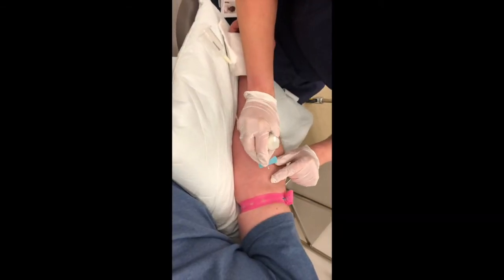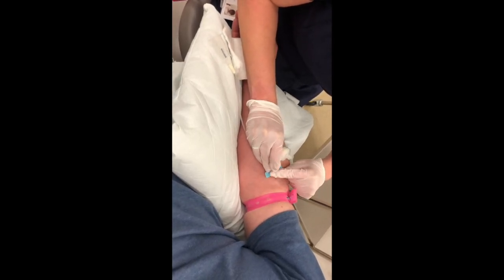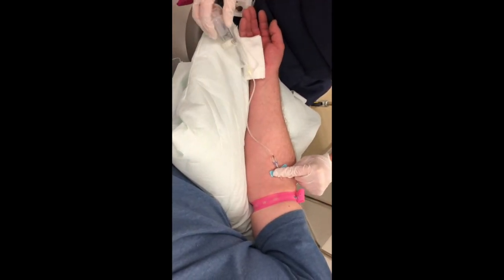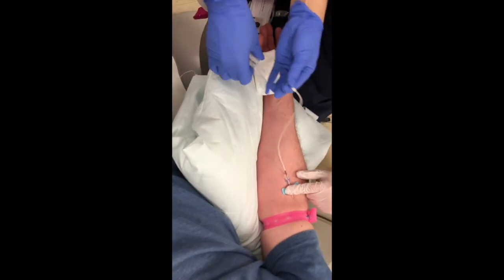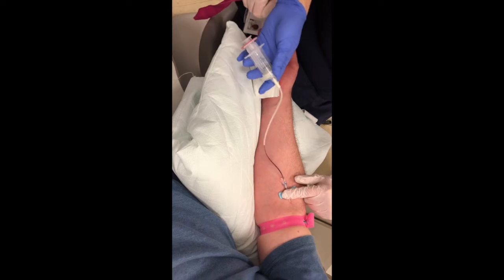The first step is to draw the patient's own blood depending on the volume required. Five milliliters of patient's blood will yield approximately 1.5 to 2 milliliters of PRP.